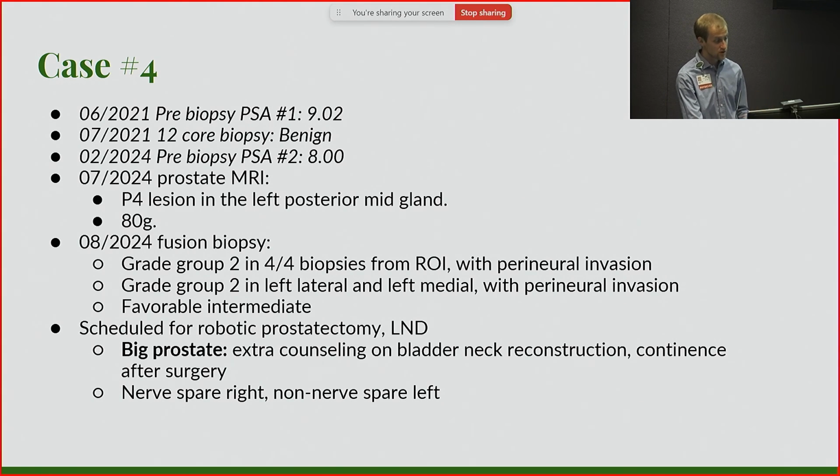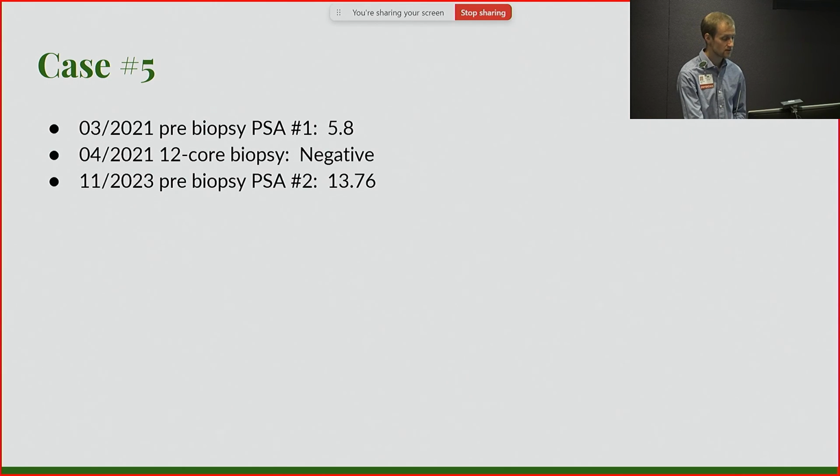I think this situation, big prostate, small lesion, is kind of a needle in a haystack phenomenon where, yes, you might hit it, but you might not if you're just taking systematic cores throughout. So just a couple more left here.